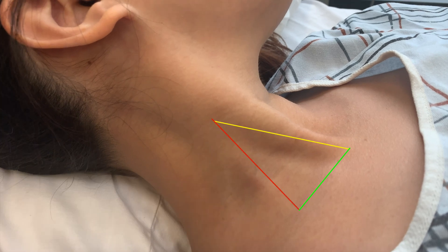As shown here, the yellow line represents the anterior head of the SCM, while the red line represents the lateral head. The approach is to insert the needle at the apex of this triangle, where the red and yellow lines meet, while advancing the needle towards the ipsilateral nipple in the direction of the green line representing the clavicle.